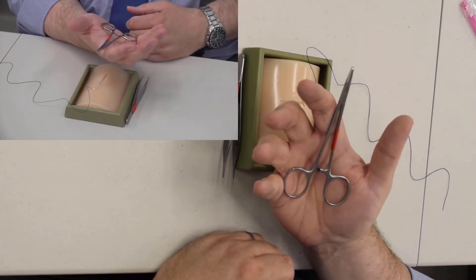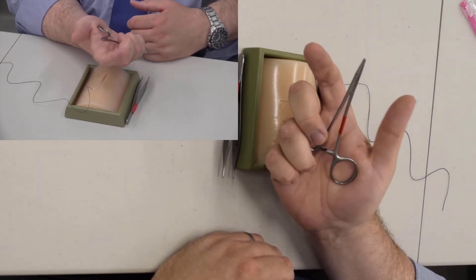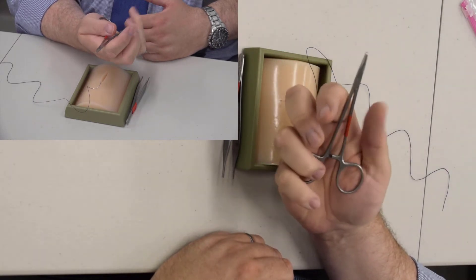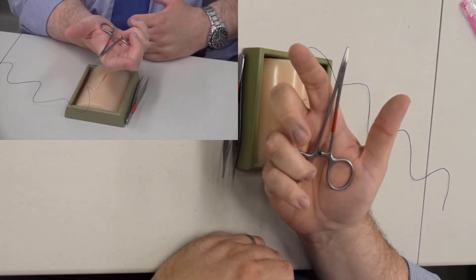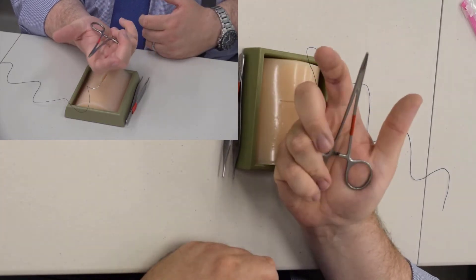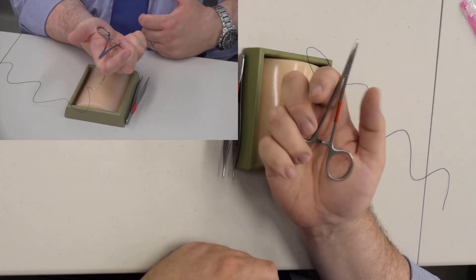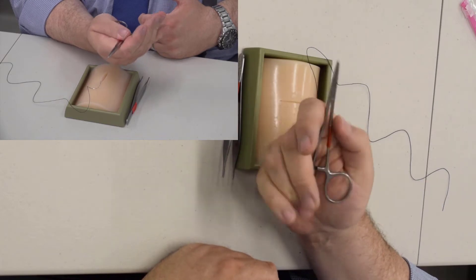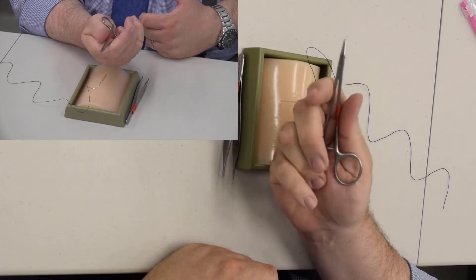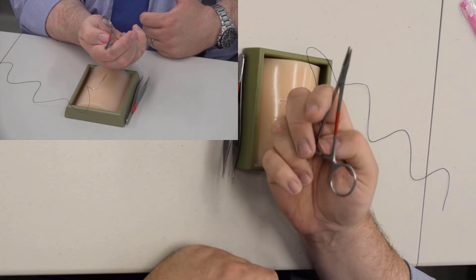Don't put your fingers in the holes. Learn to palm the needle driver and learn to open it the way I just did. I use my fourth finger, push down, and it opens on my thenar eminence on the thumb side. Learn to do this — you're going to have to carry a needle holder in your pocket all day and just open and close it.